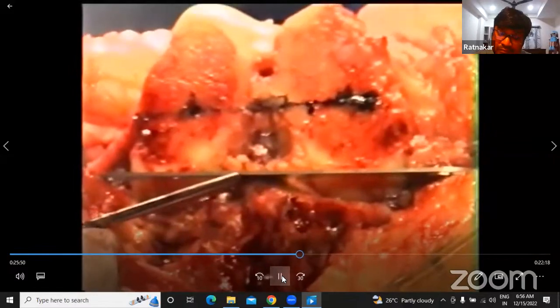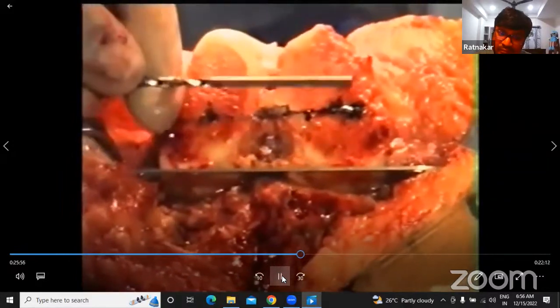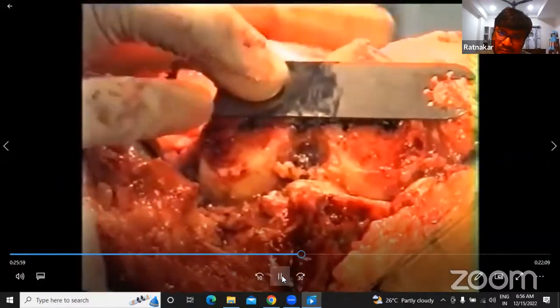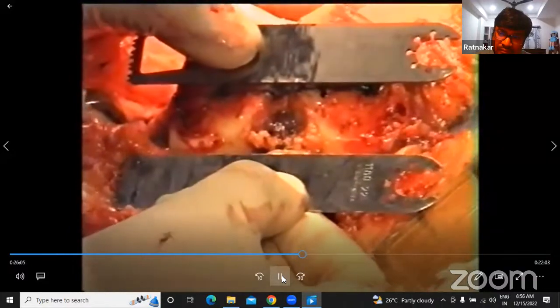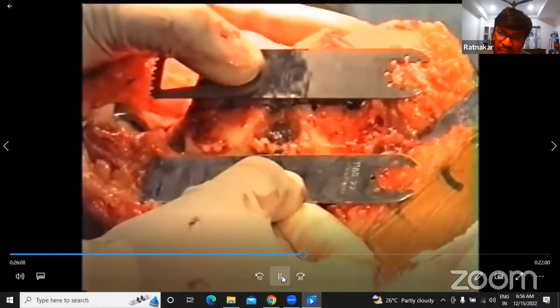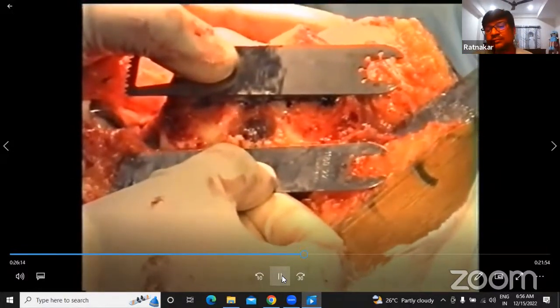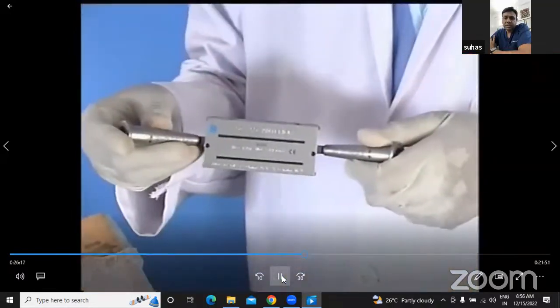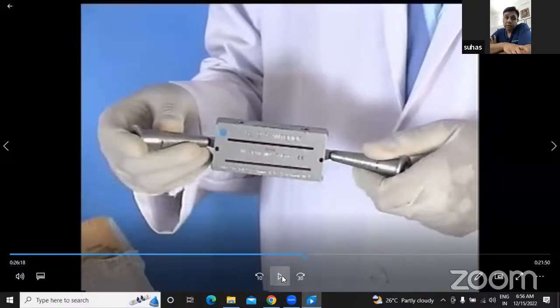This is the line of the posterior femoral condyles, and that is the transepicondylar line, which is 3 degrees external rotation to this. The most important thing about this transepicondylar line is it's almost parallel to the upper part of the tibia. You can see that. So your flexion gaps and extension gaps all will be nice if you have a parallel space between these two. So this is PFC. This has a fixed external rotation, which is 3 degrees. Other systems have the ability to rotate more or less, but PFC doesn't.